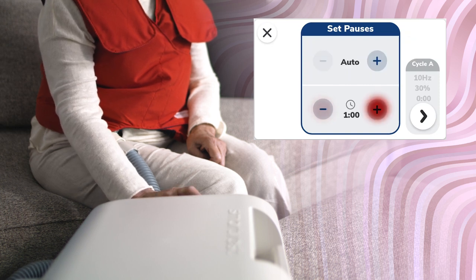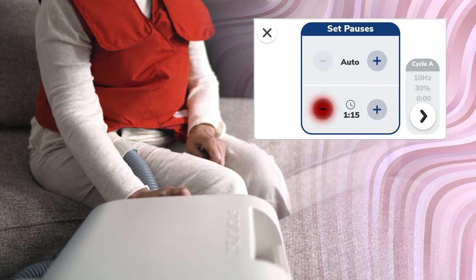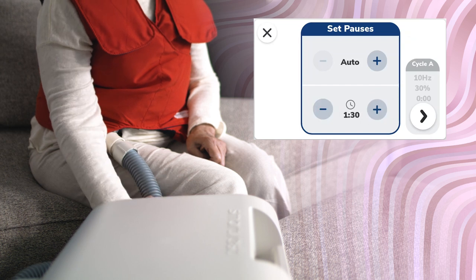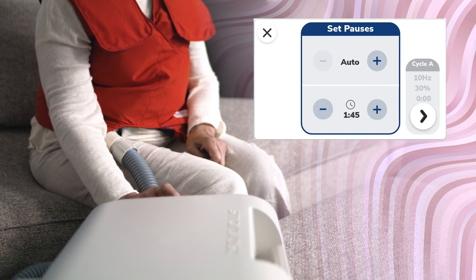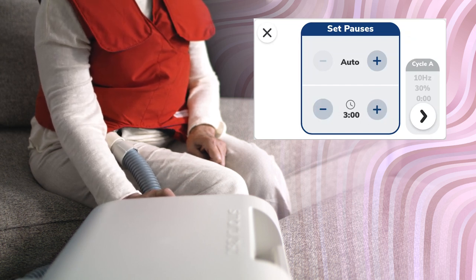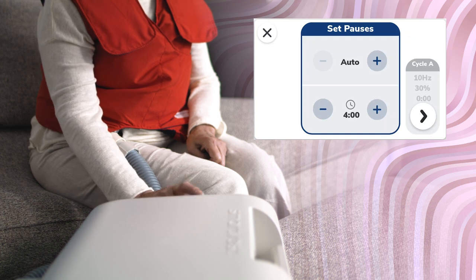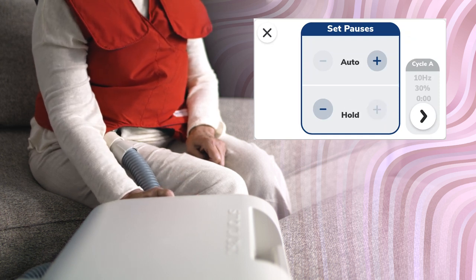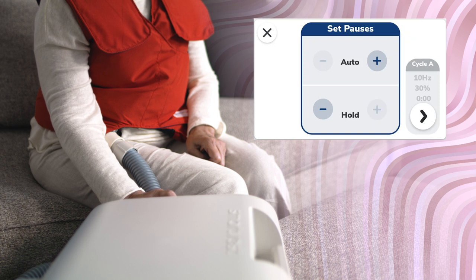Tap the plus and minus buttons to the right and left of the time display to adjust the duration of the cough pauses. They are adjusted in increments of 15 seconds, from 15 seconds to 5 minutes in duration. Or select Hold to pause therapy until the Start button is manually tapped to resume.